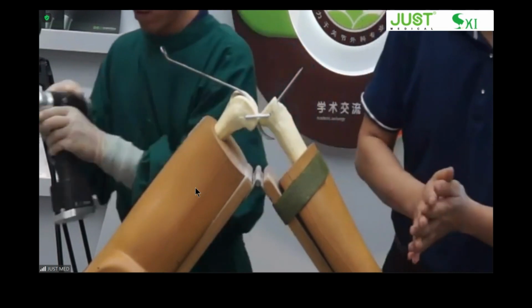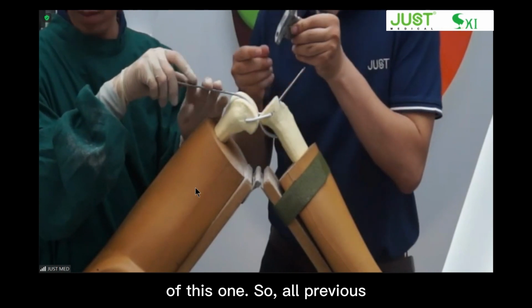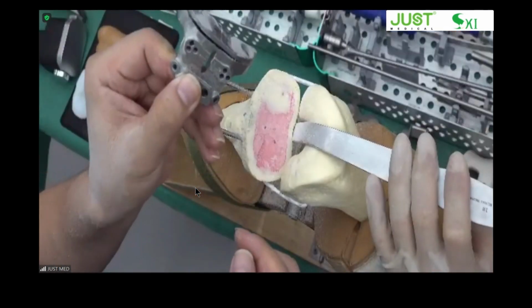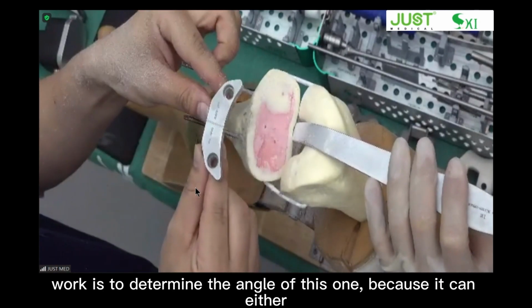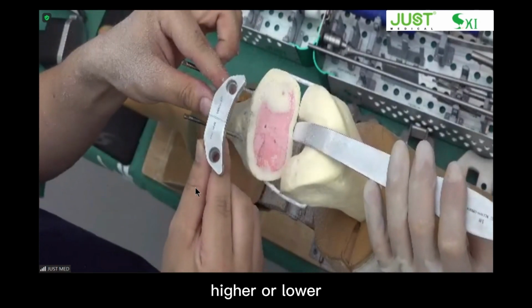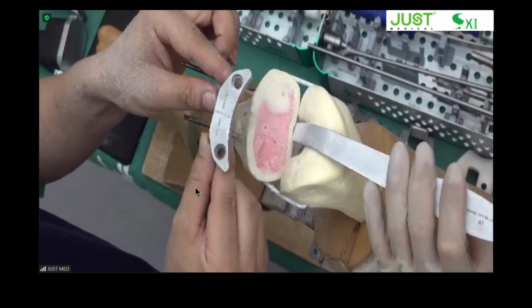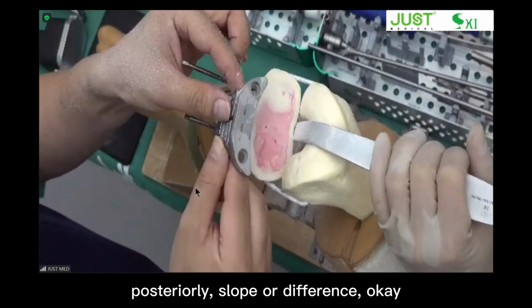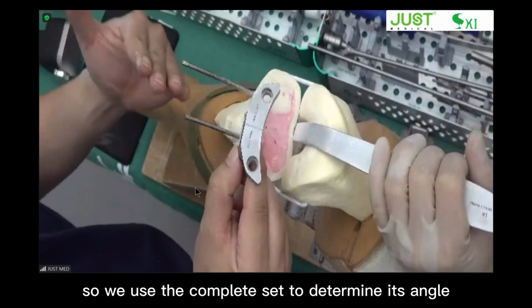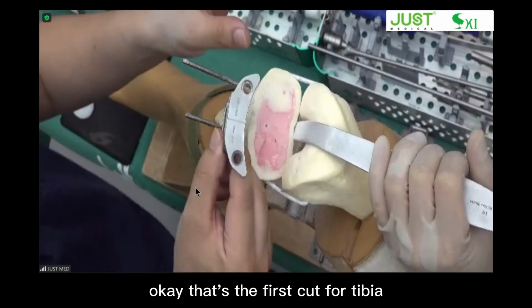Good. Now it's better. So our previous step is to determine the position of this one. Our previous work is to determine the angle of this one, because it can be either higher or lower. It can be rotated internally or externally. And posteriorly, slope or different. So we use the complete set to determine its angle. That's the first cut for the tibia.